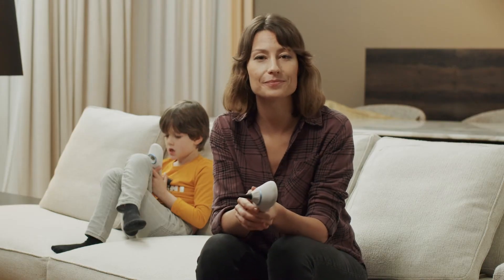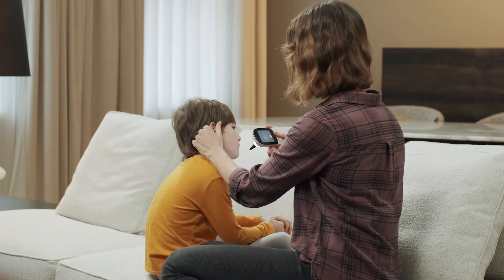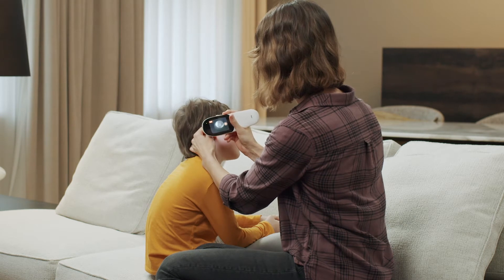Please sit up straight. Remember that you must have enough space and good access to the patient. Next, slightly tilt the patient's head to the side. This will make the exam more comfortable for both the patient and the examiner.